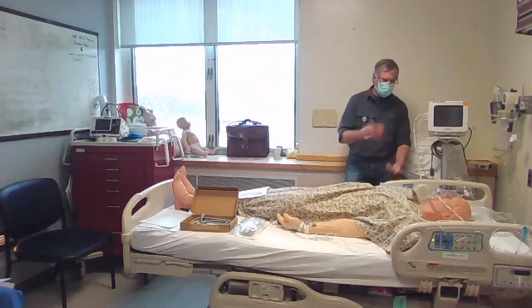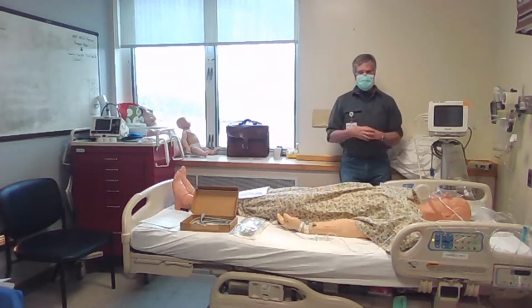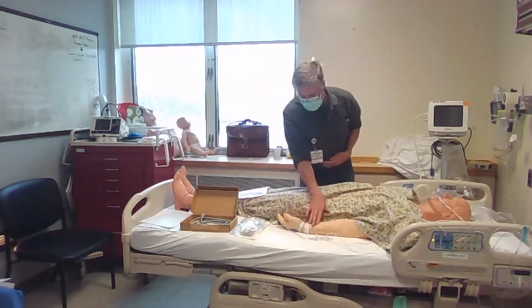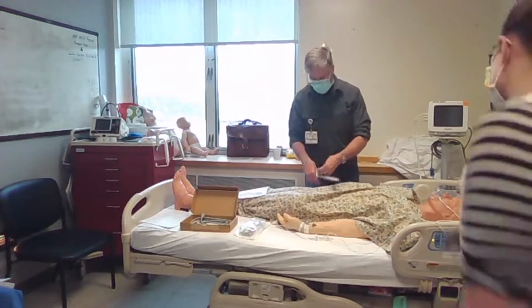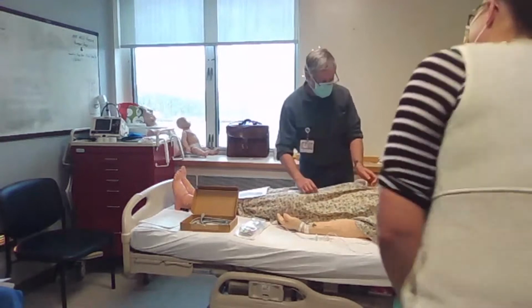So I'm just going to start going through a couple things. Like I said, it's continuous pressure monitoring. You don't have to wait for it. It's just there. You can watch it. The typical pieces are a catheter, which is going to be, this is a triple lumen, but there's a catheter right here on the end of this. And I'll show you the Arrow kit, which is a really nice kit to do it with.